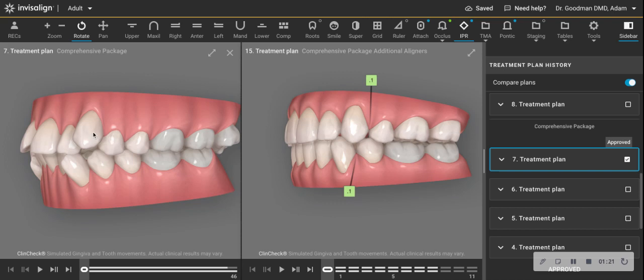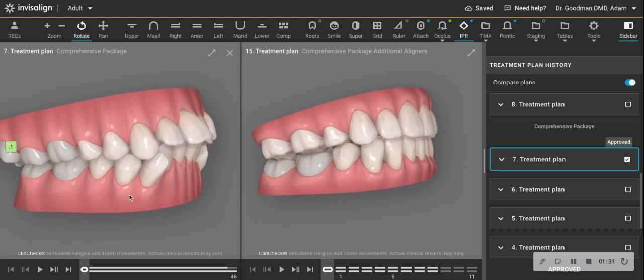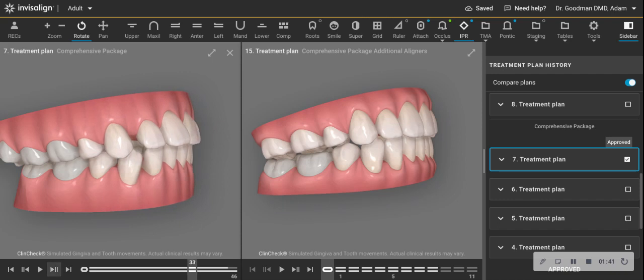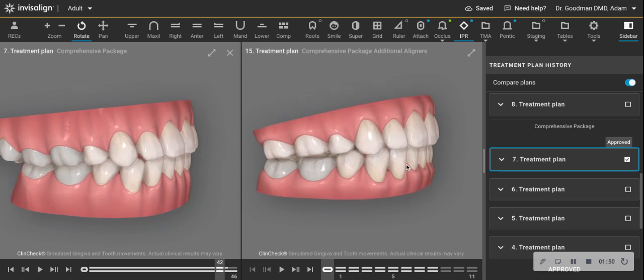So the tooth can't really tip. But the key is this tooth actually needs distal crown tip. This tooth needs distal crown tip. Now, in the ClinCheck, I have it planned where you see fairly bodily movement, but I knew there would be some tipping, and I knew that I could sort of get by with it because tipping the crown would actually make it be into a better angle.